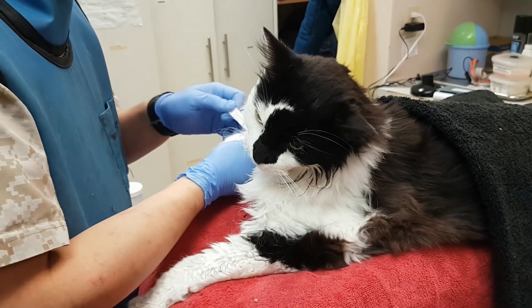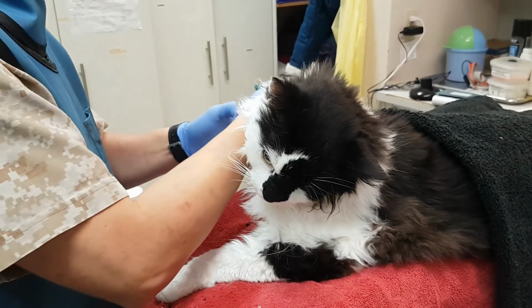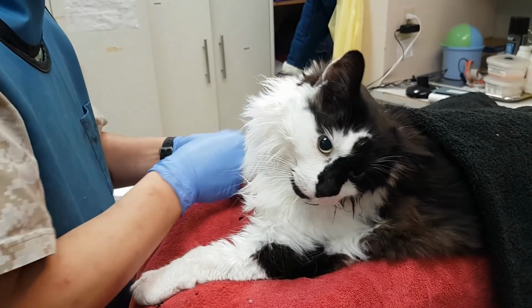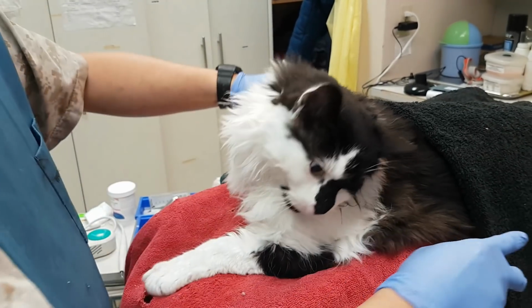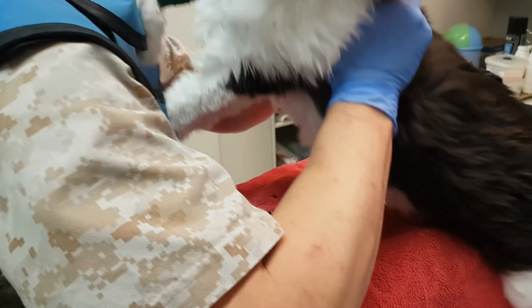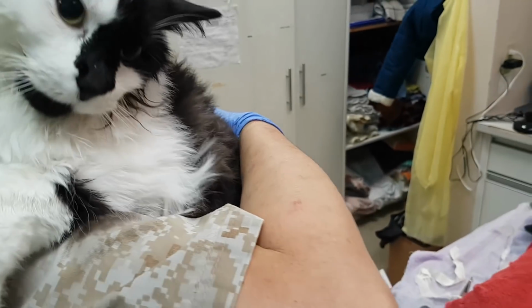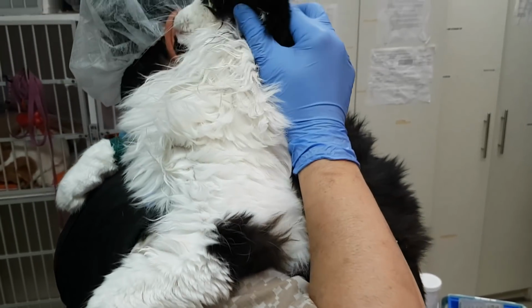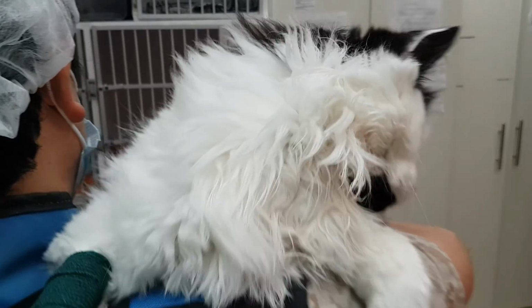Here Mr. NJ is pulling the catheter. He's going to put a little bandage around the catheter site just for a little while, to make sure it doesn't bruise. Lancelot has no idea what's going on. He's just seeing butterflies, wondering what happened. He's probably not even actually conscious yet. You can tell his pupils are all dilated, so chances are the light's on, but nobody's actually home. Of course, you could say that about a cat most days of the week.